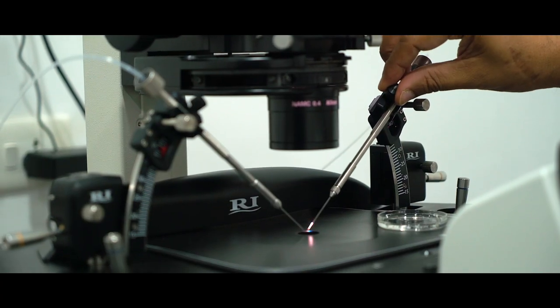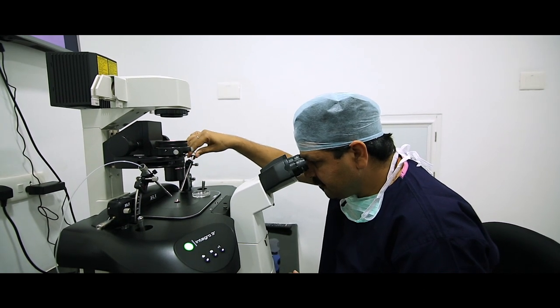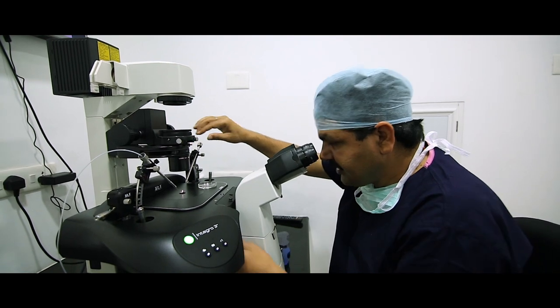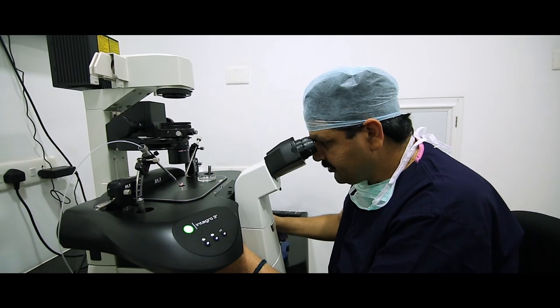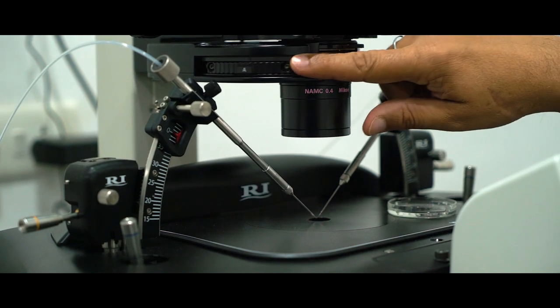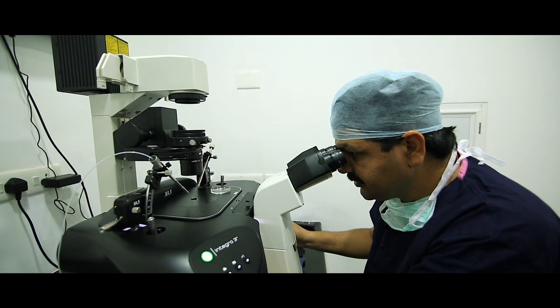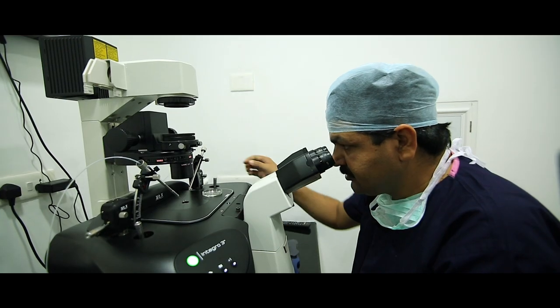Lower down the middle and you can see on the screen that the machine is aligned. This is at 4x; now I am going to 10x — a little bit more magnified. And we can see on the TV screen one side is holding and the other side is injection. At 20x, my machine is now aligned.